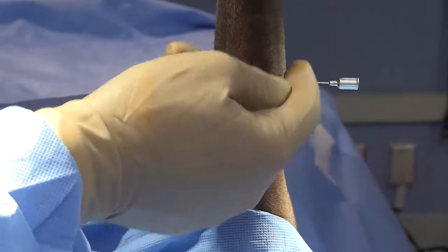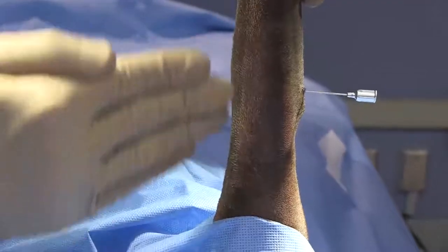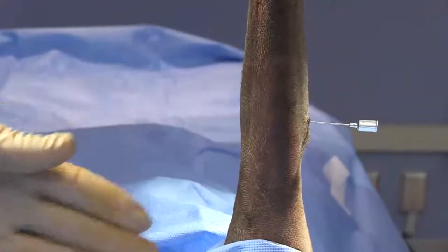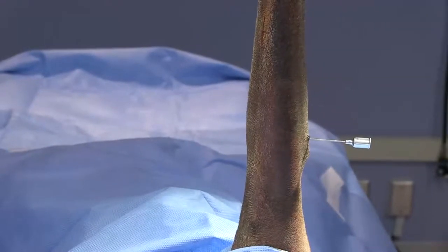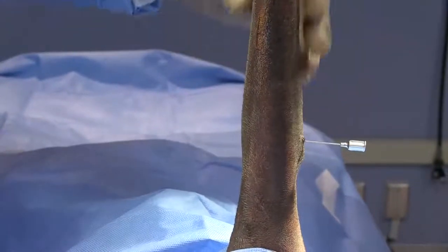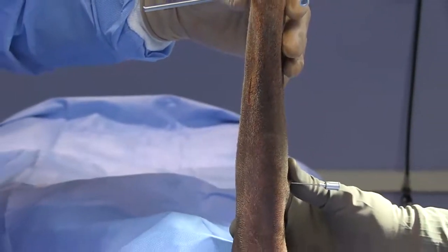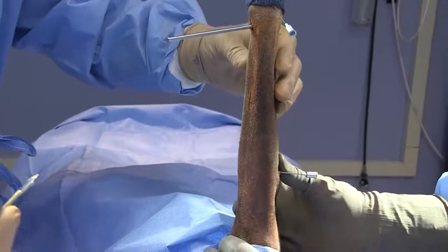The next pin goes at our most proximal extent. We've got our joint delineated here, basically telling us where our elbow is. We know the radius is just distal to that site, and we'll place the pin in the same plane — cranial medial — since we're creating a type 1 construct. We want to get these pins relatively in the same alignment on that cranial medial aspect.